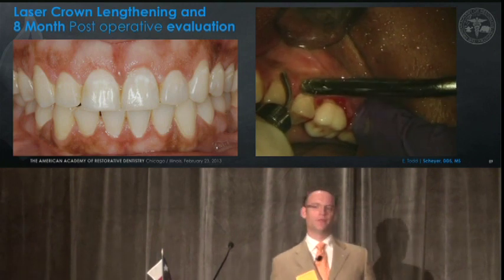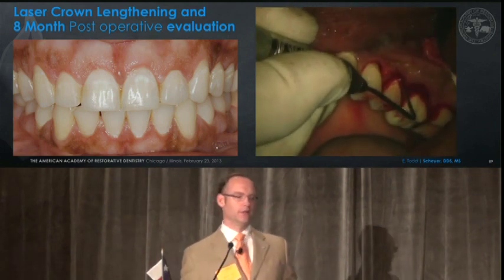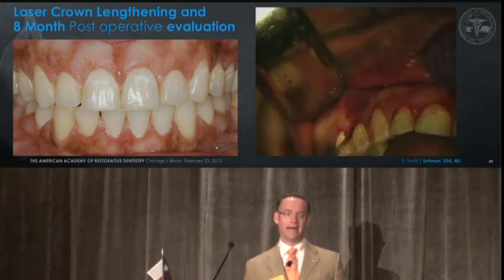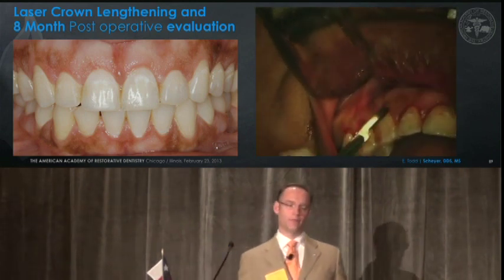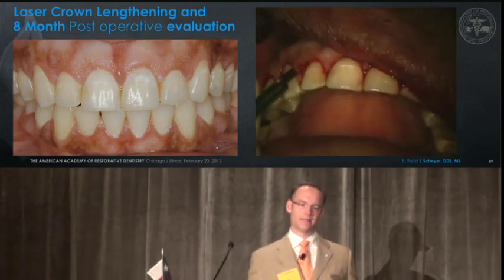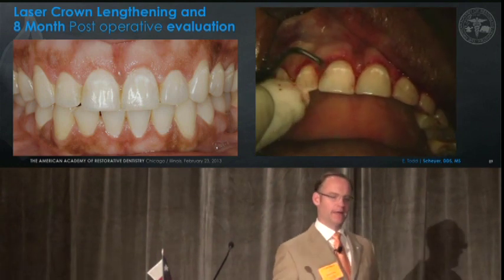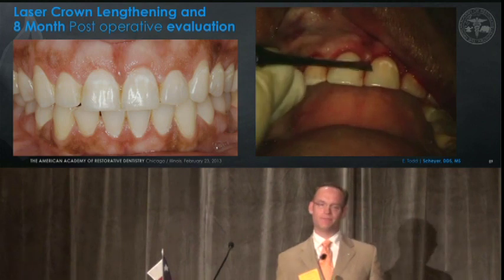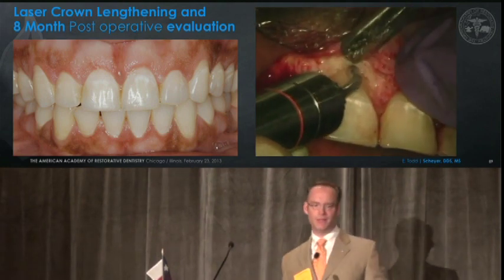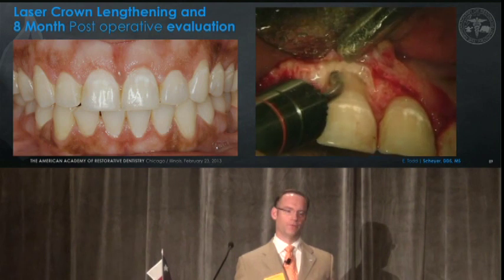One thing to note: if you're using diode lasers you expect some coagulation, but with the erbium YAG you're not going to get that same coagulation based on the medium. I went back with a curette to clean out any small fragments left behind, and now we're moving on to a 15-blade to reflect the flap on the right side of this patient. Using an Orban knife to assist with the beginning of flap reflection, then to a Glickman elevator, and introducing the erbium YAG laser tip to do bone recontouring — you can see the very jagged edges of bone left behind from the flapless approach.